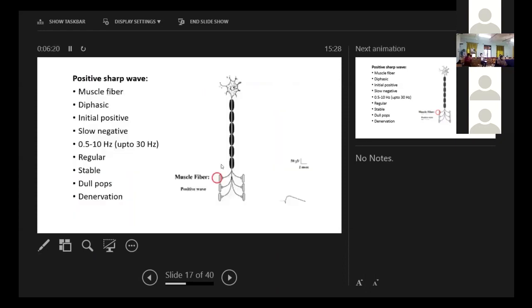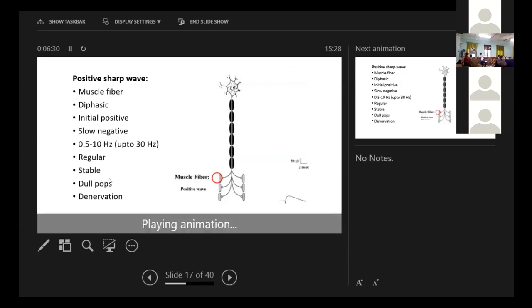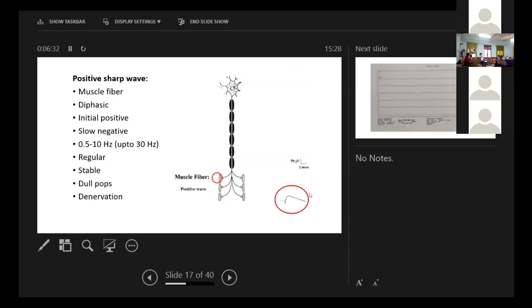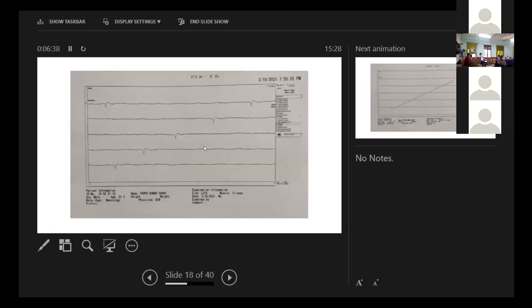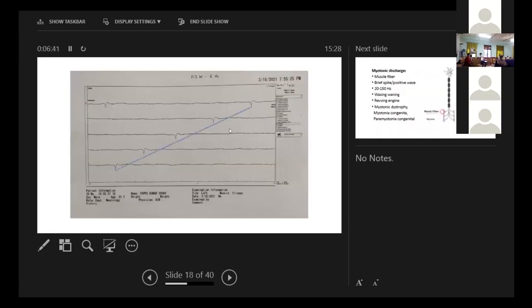This is again a positive sharp wave. It also comes from the muscle fiber. It denotes denervation. It sounds like dull pops. It's more or less regular and stable. The only difference with the previous one, there is a slow negative phase. So this is a positive sharp wave as seen in the tracing.